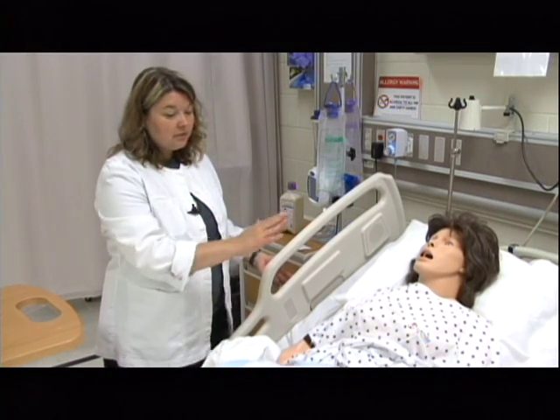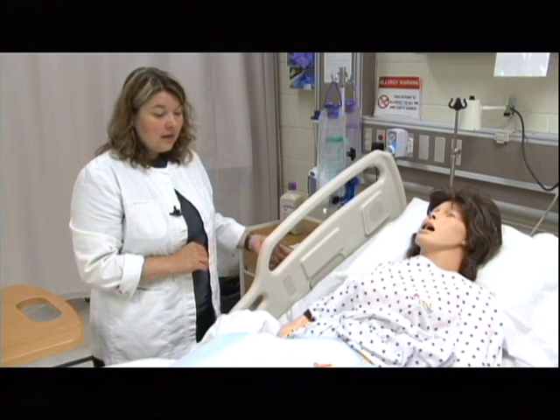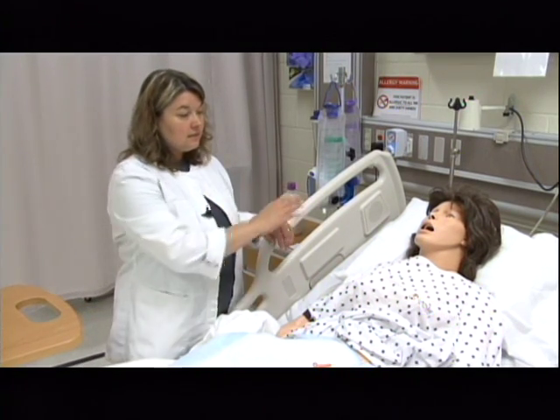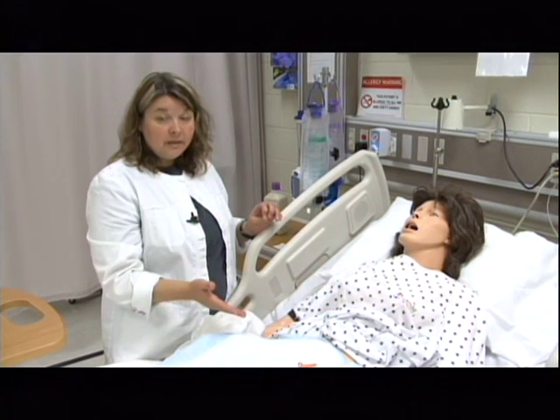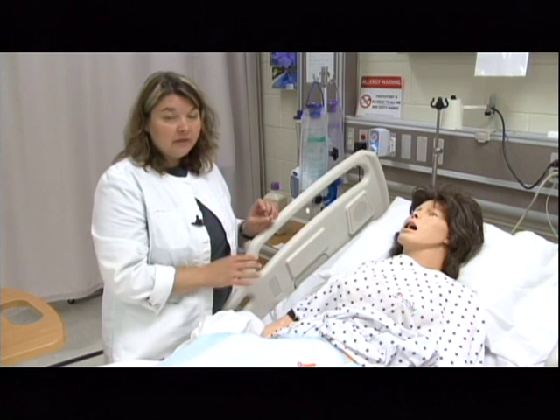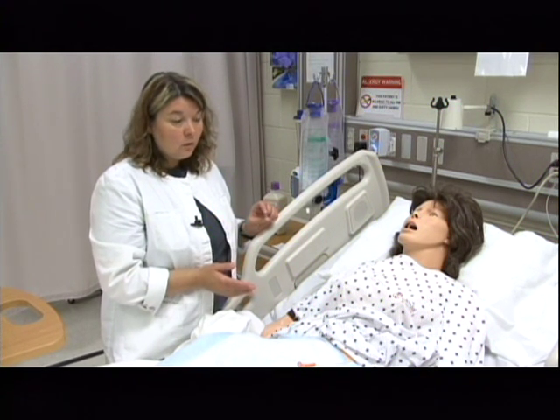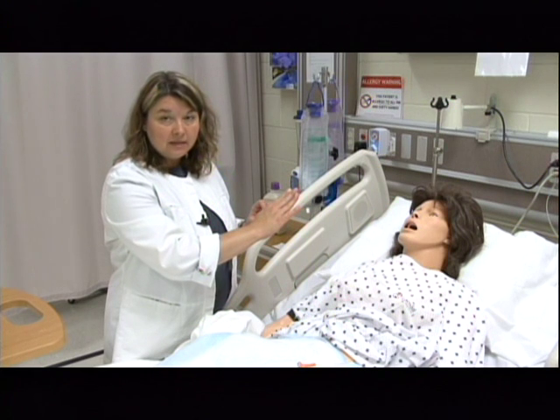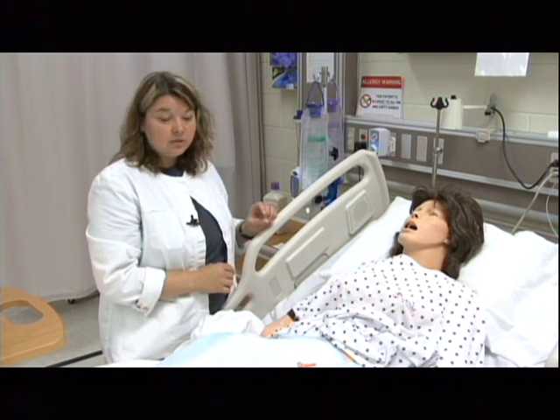And then as far as positioning of her, if I'm going to give feedings, I need to make sure that she is at least 30 to 45 degrees in height. And if this is an intermittent feeding, which it is, she needs to stay at this height for a minimum of an hour after the feeding. If the patient has continuous feedings going, then she always needs to be maintained in a height of 30 to 45 degrees, unless there are contraindications for that.